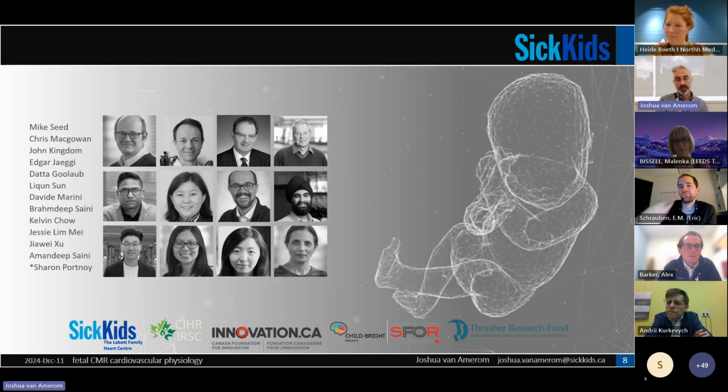Sort of peppering the region of interest with lots of images, and then putting things together after the fact, or even with what we're doing with radial phase contrast acquisitions, where we can tease out the motion that has happened and do some data rejection and so on. For flow measurements, a direct 4D flow acquisition is really appealing, especially if it is motion robust.